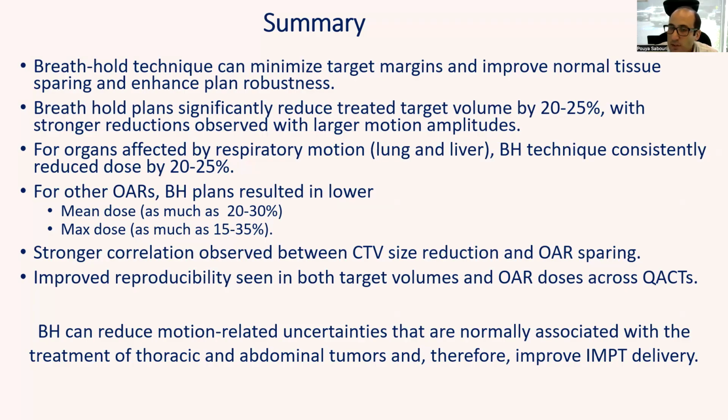And finally, we looked at the reproducibility of the QA-CTs for both target volume and OAR doses, and these were also fairly consistent, which is important for a technique that may seem a little tricky to implement clinically. Overall, breath hold did help us cut down on motion-related uncertainties, especially for thoracic and abdominal tumors. And in turn, that makes IMPT delivery both safer and more effective.